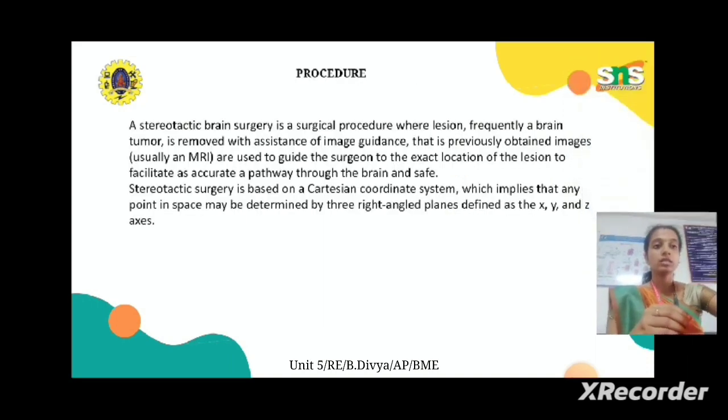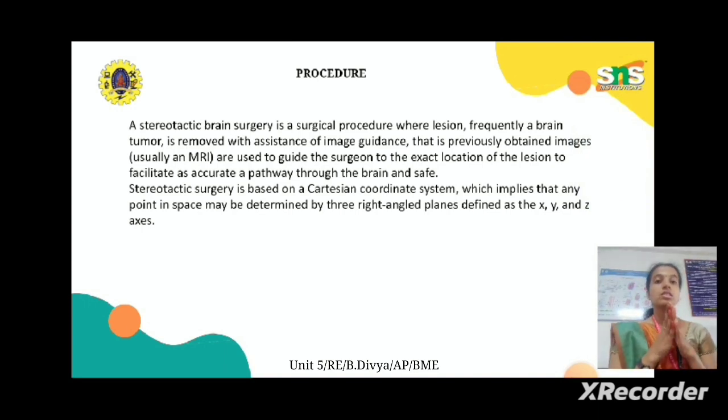Here is the procedure, how the stereotactic procedure takes place. Stereotactic brain surgery is a surgical procedure where lesions, frequently brain tumors, are removed with the assistance of image guidance.